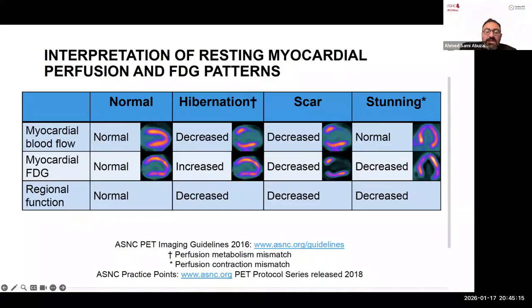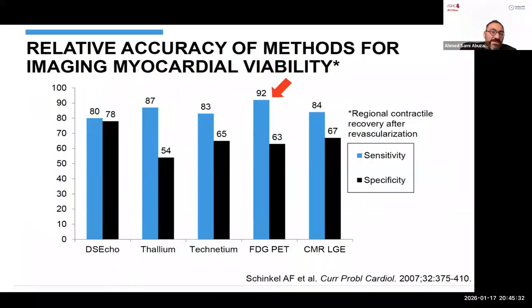And I think, depending on how you look into it, no other modality is going to give us all of this robust information, specifically if you're looking at complex coronary artery disease, between rest, stress, and viability. Sometimes we can combine that in the same day, sometimes on different days, depending on your protocol.